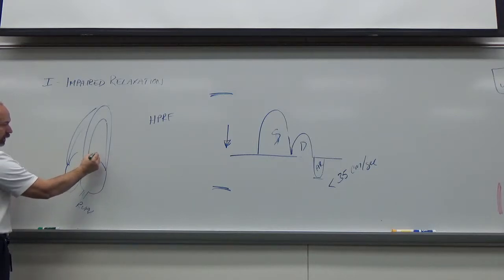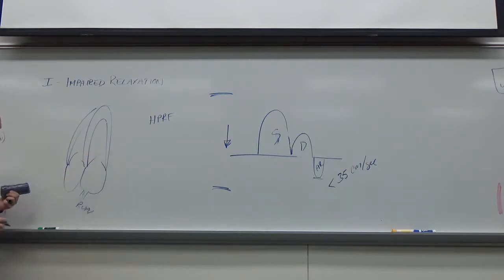If my cursor happens to come right here, I've got a very intense waveform happening right there that's going to overpower this waveform because this is very slow velocity. Low flow, more difficult to see. So anytime I get a sample gate that comes in a more intense waveform, that's going to overpower what you see. So the way to fix this is to decrease your scale.